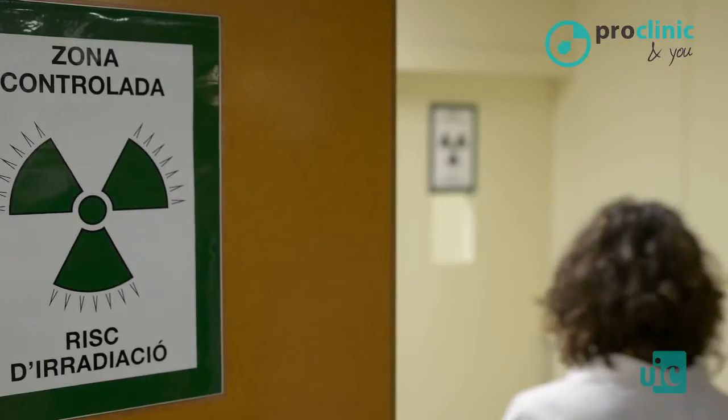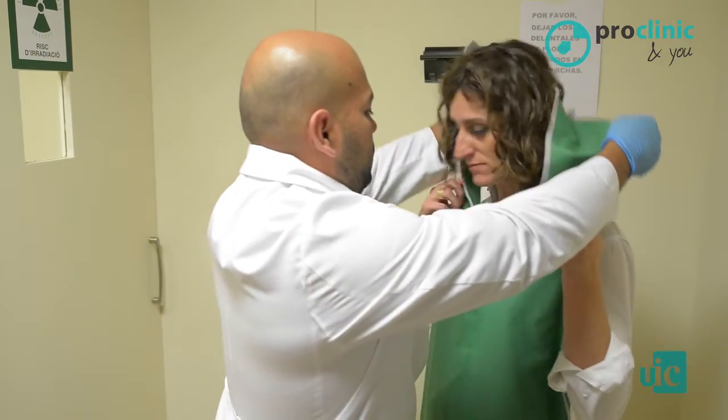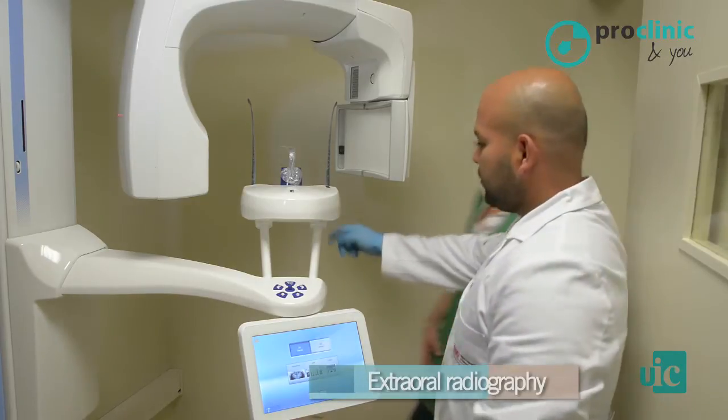Radiology is an essential tool in the dental field because it allows us to make a correct diagnosis and treatment planning. Thus, dental radiography allows us to see structures that we may overlook at the patient's first visit or during conventional clinical examinations. There are basically two types of X-ray films, the intraoral and extraoral radiographs.